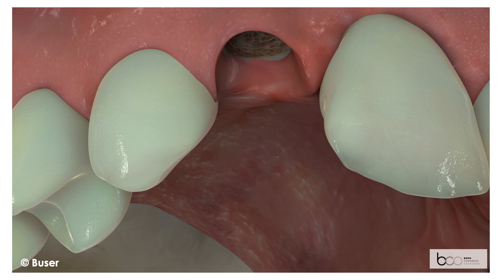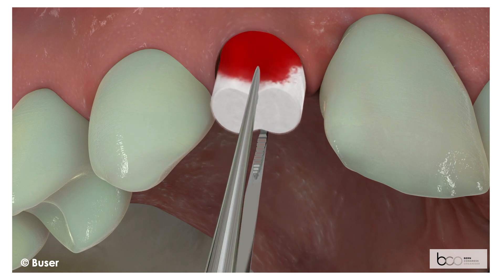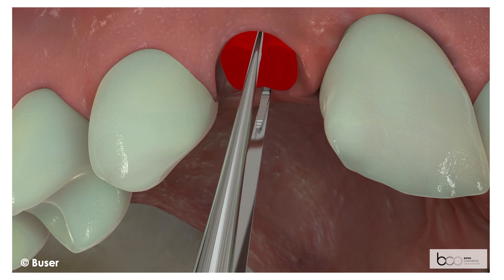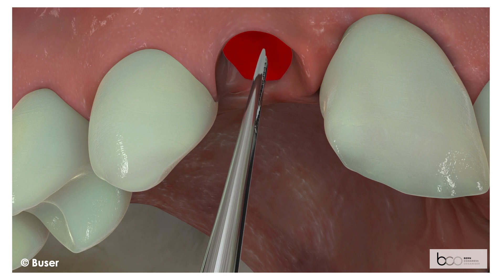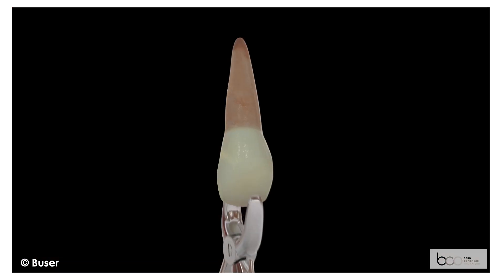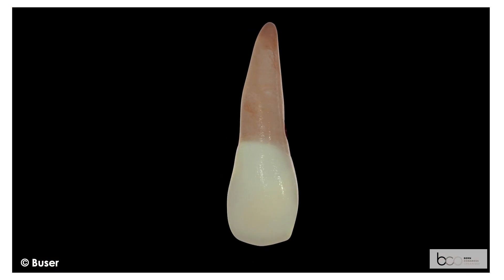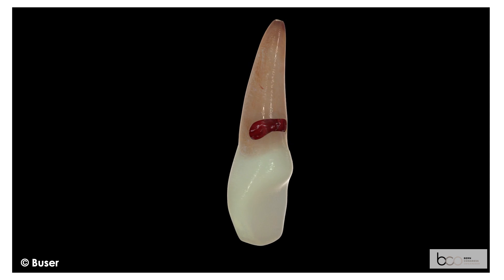A collagen plug is applied for the stabilisation of the coagulum and the socket is left to heal by secondary granulation. The removed tooth shows the area with the external resorption.